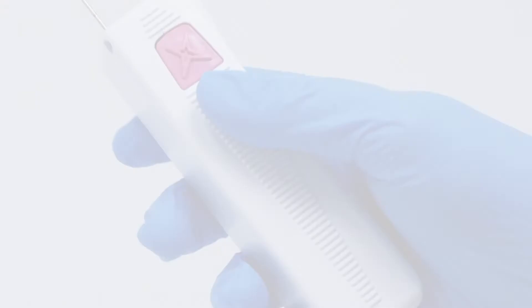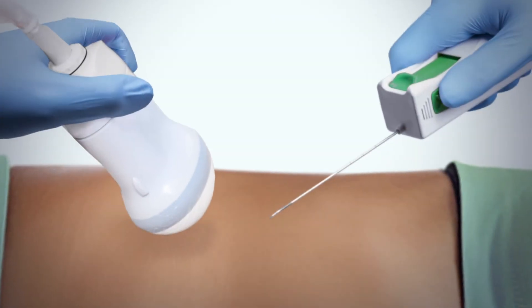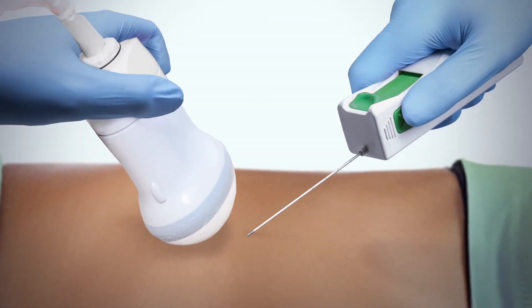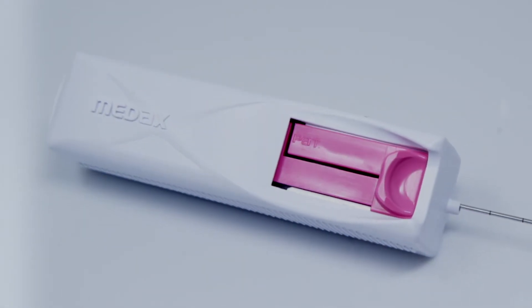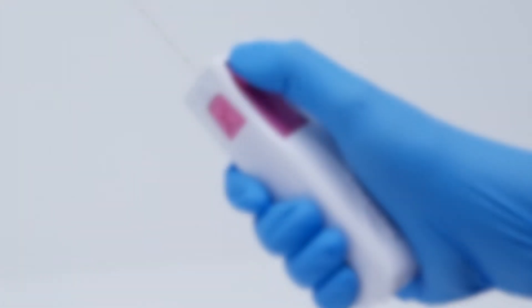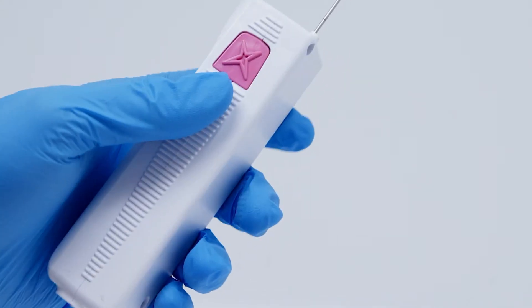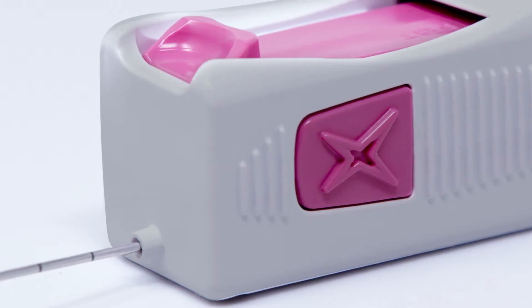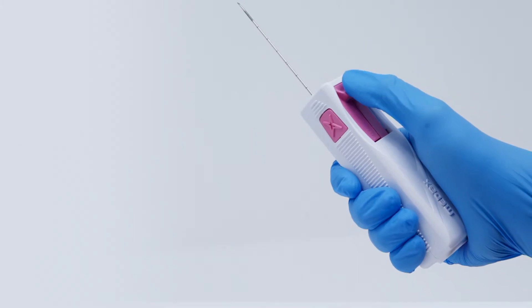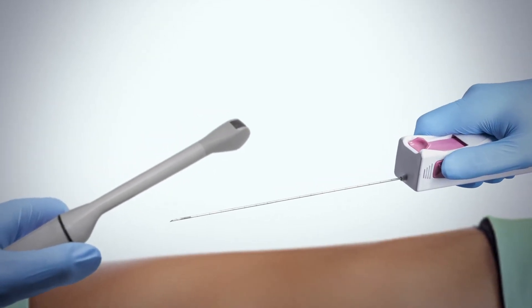It helps single-handed free procedures enabling the physician to hold the ultrasound probe or other imaging guidance devices. Thanks to both the intuitive loading mechanism that can be managed with a slight movement of the hand, ideal also for left-handed operators, and the comfortable position of the trigger buttons, MedOne can be easily used in combination with abdominal and intra-cavity probes.